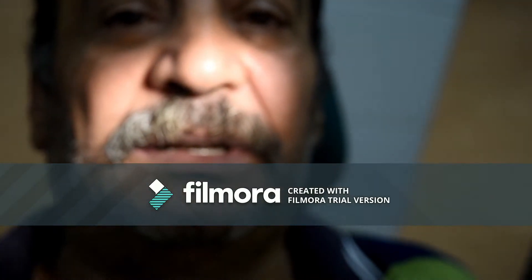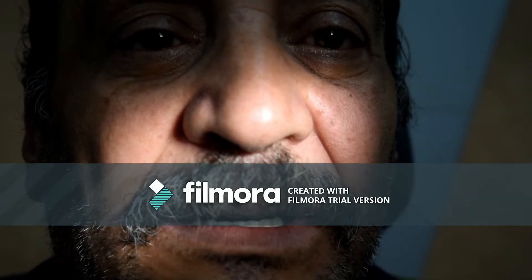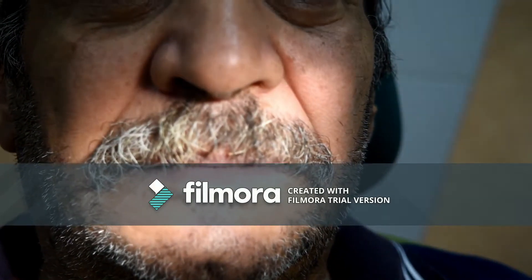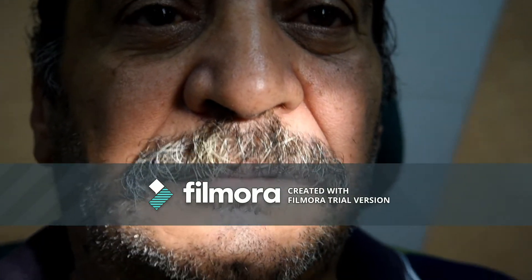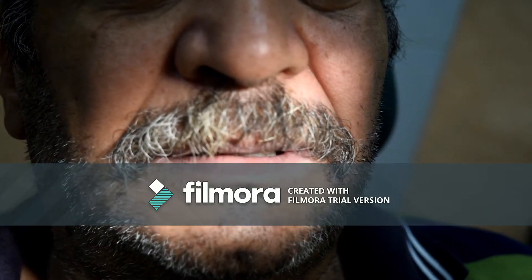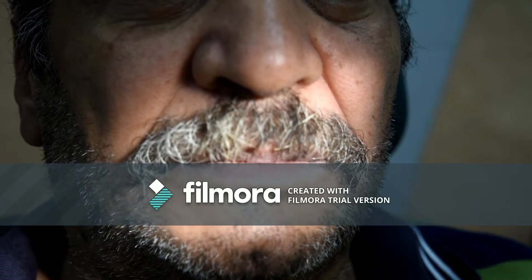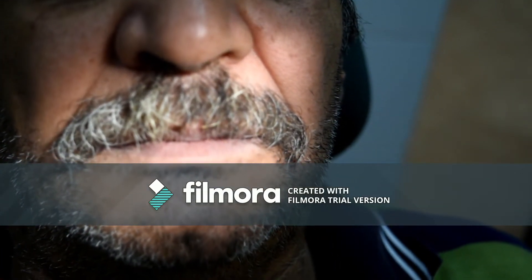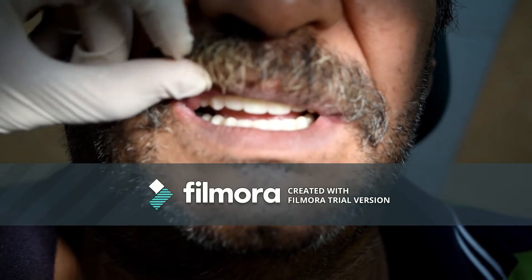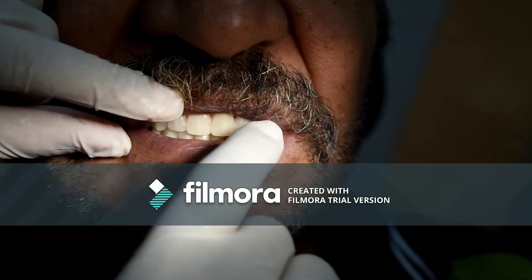Regarding phonetics, during the pronunciation of the 'S' sound, you can check the closest speaking space. If the patient says 'CH' instead of 'S,' this means there is insufficient horizontal overlap or the upper palatal portion is too thick, and this has to be corrected. If there is whistling during the pronunciation of the 'S' sound, this means there is increased horizontal overlap, which should also be corrected. You can also check the letter 'F': during the pronunciation of 'F,' the incisal edges should touch the dry and moist surface of the lower lip.